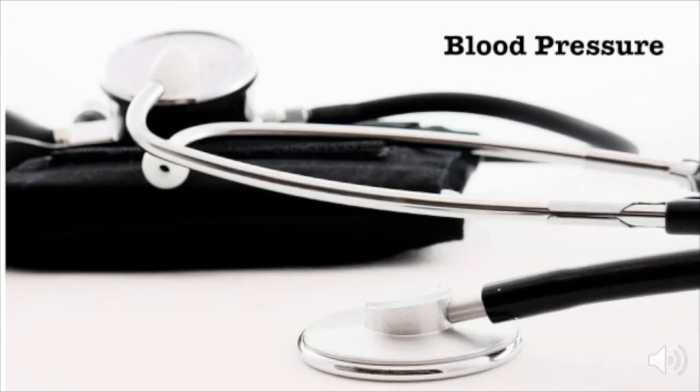Obviously, respiratory rate and temperature are not going to be any different in an LVAD patient versus a non-LVAD patient, so those two are easy. But what about the heart rate? Well, think about it. The heart is still beating even with an LVAD. You should be able to obtain a heart rate on an automatic monitor. The heart still has electrical activity, and the monitor should still record this. This is the case even if the patient is in an arrhythmia, but there'll be more to come on this issue a little bit later.